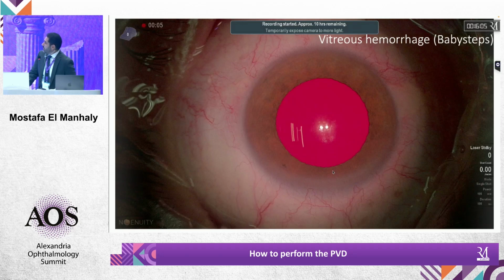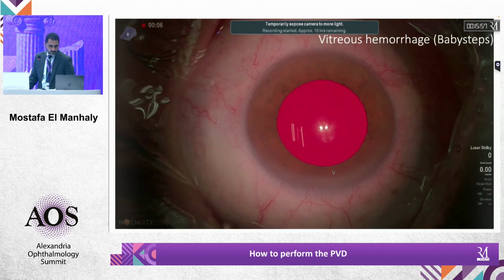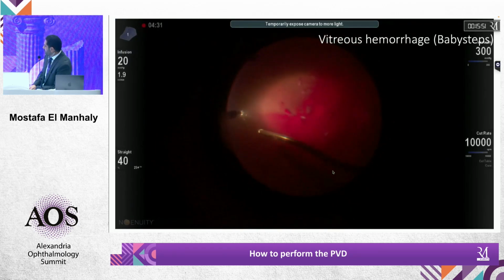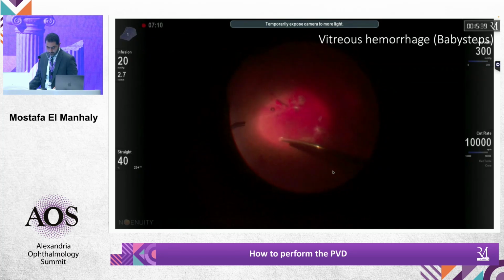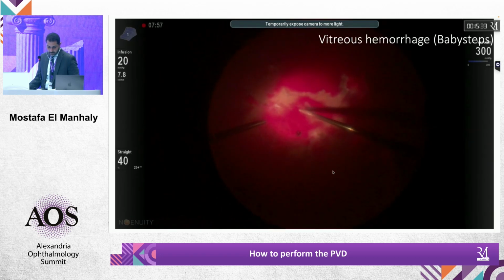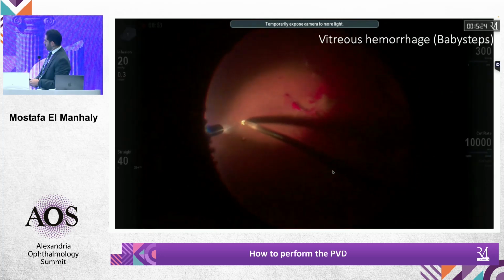So, Dr. Moghazi, this is a case of a vitreous hemorrhage. So how would you approach such a case with a vitreous and subhyaloid hemorrhage? Well, you mean talking about PVD again? Yes. Okay, so again, I will do a core vitrectomy, and in those cases, after doing an initial core vitrectomy, just to see the extent of the blood and whether it's subhyaloid or just intragel, because sometimes you don't see at the beginning, I would go periphery first. If I have a subhyaloid hemorrhage that's covering the whole retina, I don't see the details, I go to the periphery first, try to create a break in the posterior hyaloid.